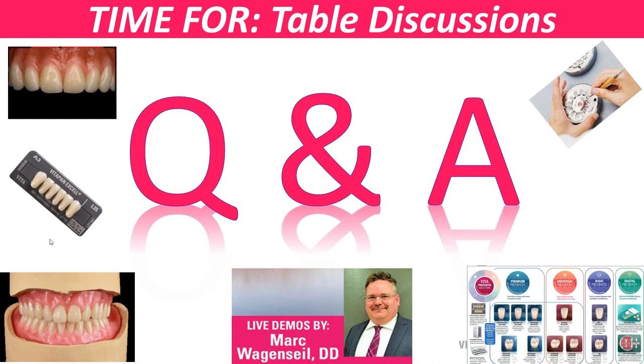So from that case where I had that setup, when I set the anterior teeth and I had to get the lower in at that vertical, I realized I have some problems here. I need to follow that type of setup. That came from once I had the bite taken and saw the model analysis and saw where the teeth needed to set, those lower anterior teeth were going to be quite buried in occlusion. It was a whole piece of the pie leading me down that path, that I needed to give that aggressive amount of overjet and overbite on that person, especially the overbite on that specific case.